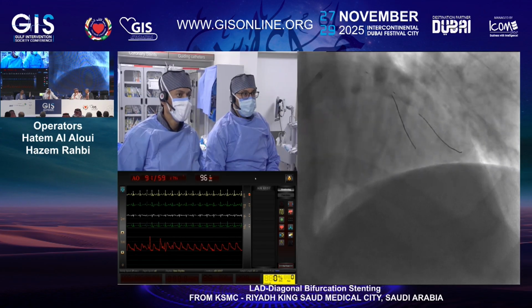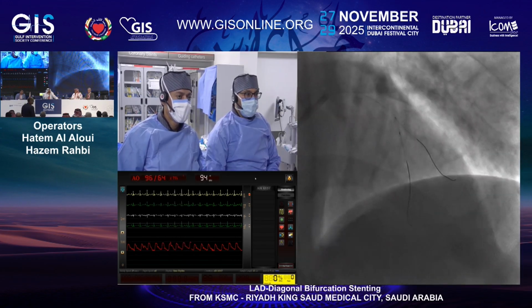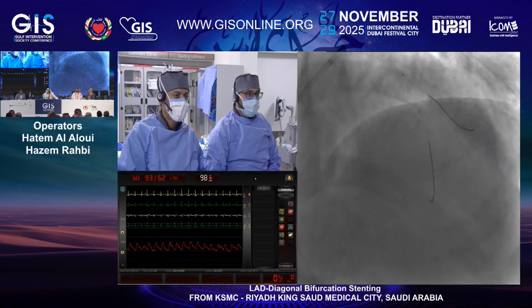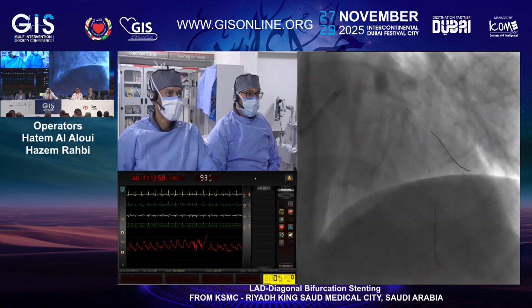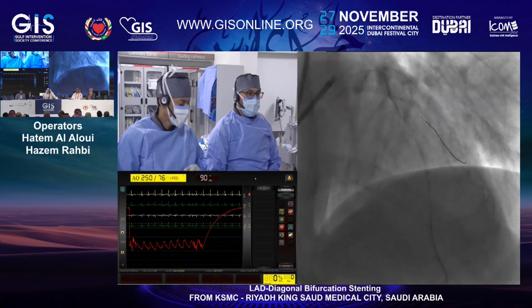The question now is use a long stent or short stent? Of course, long stent back to the proximal, and you have to cover the lesion from this. Short stent, you mean after the takeoff of the diagonal? I mean precise stenting. He's going to stent across the diagonal, but not go back to the proximal. You need to have enough length.